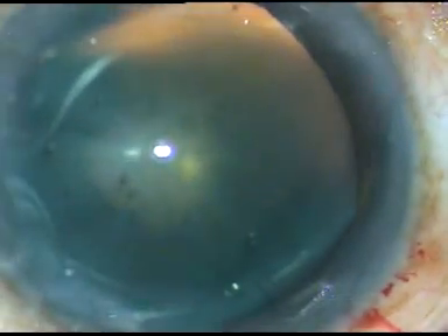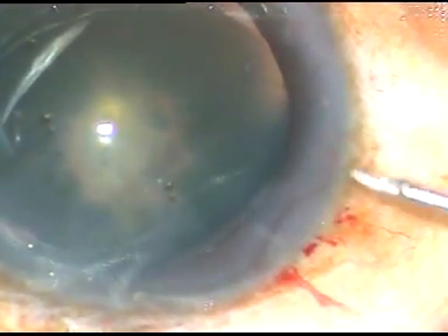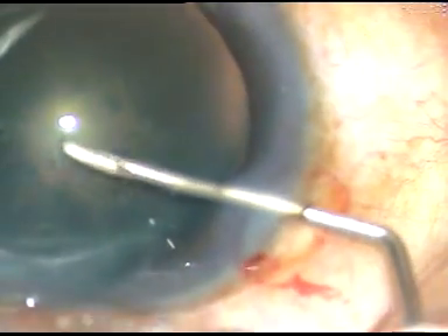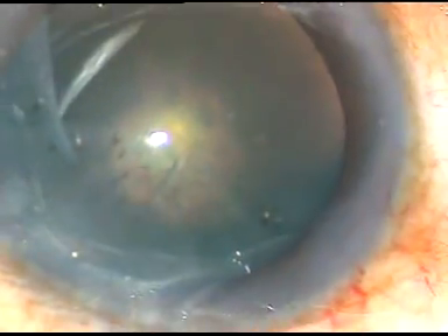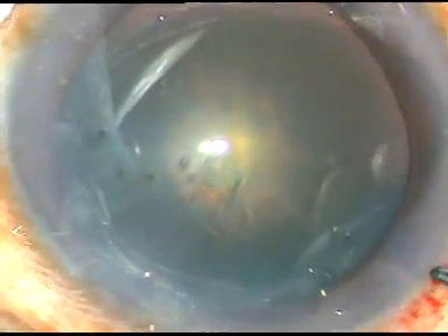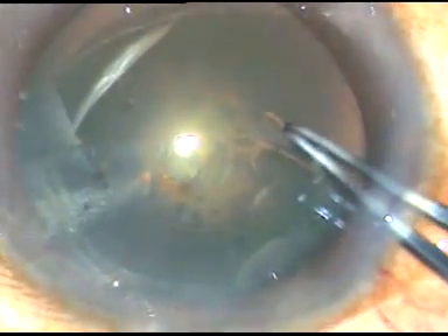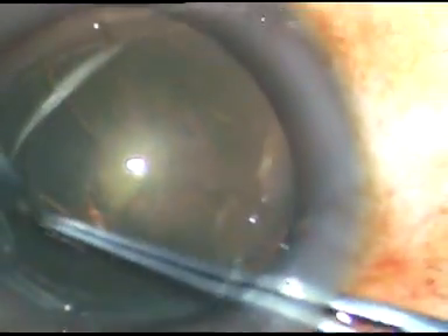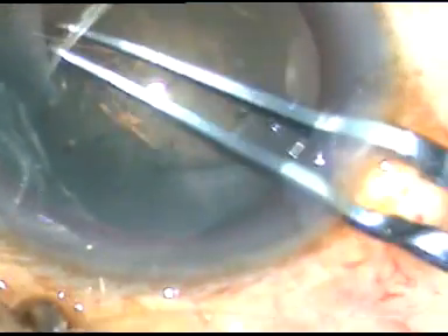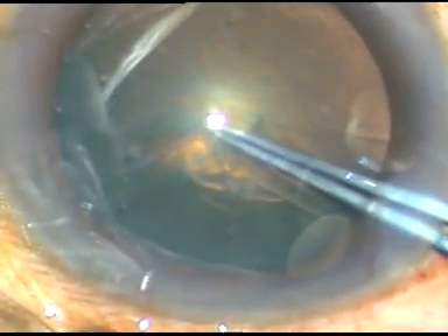Now capsulorhexis is to be done. I am introducing the bent needle to the main incision, incising the capsule and raising a flap. I hold this flap with Utrata forceps, go anti-clockwise, and perform a CCC — a continuous curvilinear capsulorhexis.